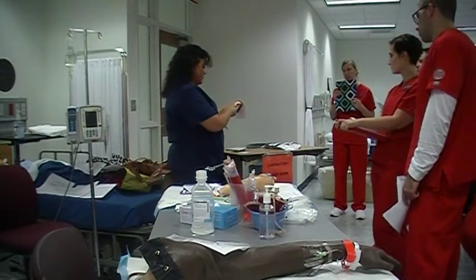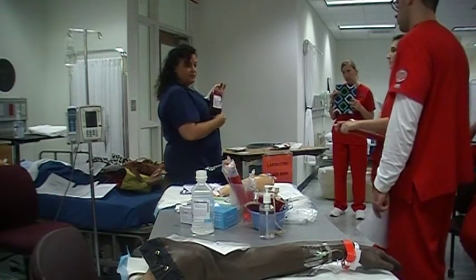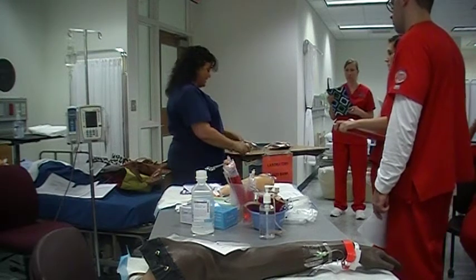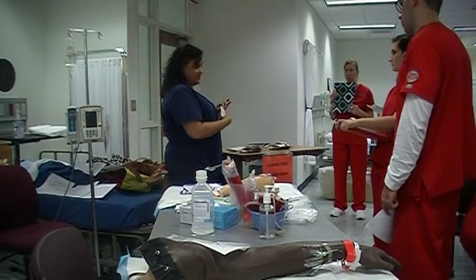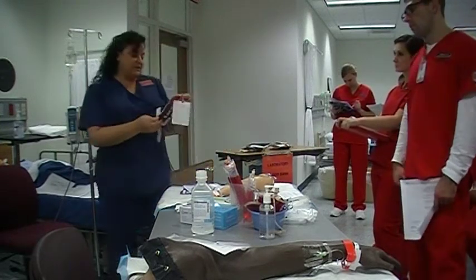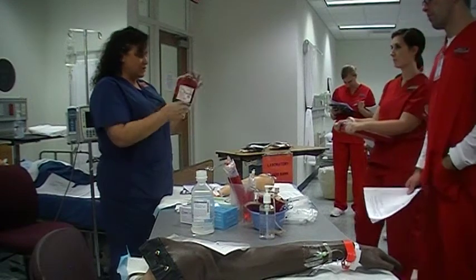This patient's A negative, so could they take B positive? Okay, so we get rid of that one. This is O negative, could they have O negative? Yes. AB positive. Okay. So he is A negative. He can only have A or O, and it has to be negative. So these two are our choices, but because he's A negative, let's just take his blood type, which is A negative, okay? So we have the correct blood, and when you're walking back to the lab, you want to inspect it back to the room for clots, bubbles, leaks. That's one of your checkoffs, I think. Make sure that the blood appears okay.